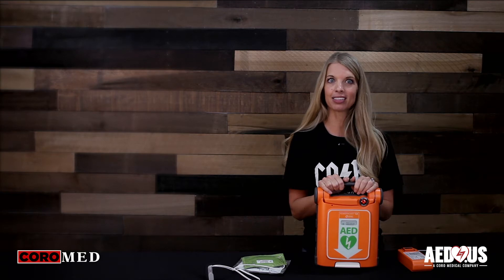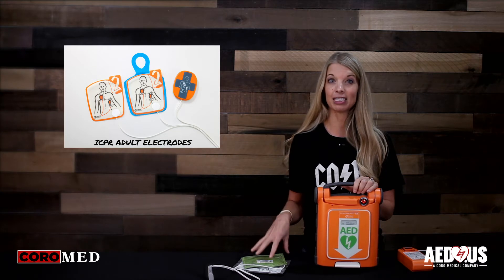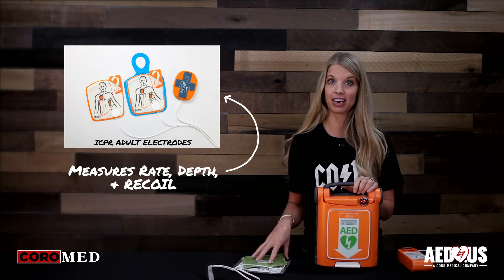There are two types of adult pads that will go with this unit. One is the standard electrodes and the other are the ICPR pads that have CPR feedback and will correct you if necessary.